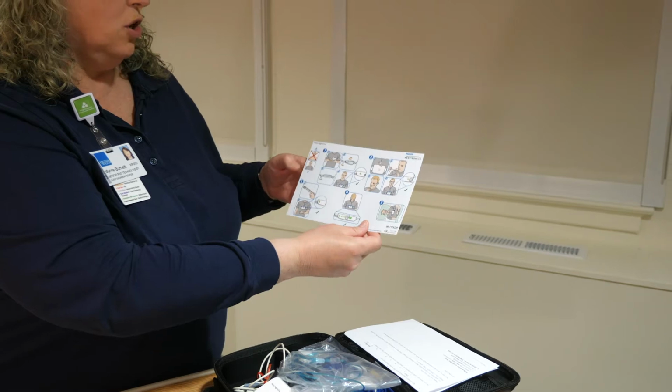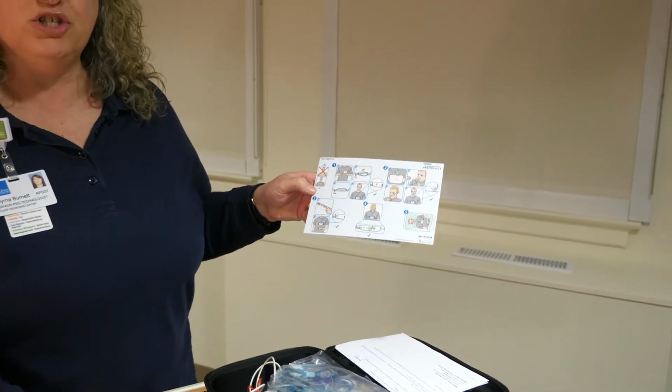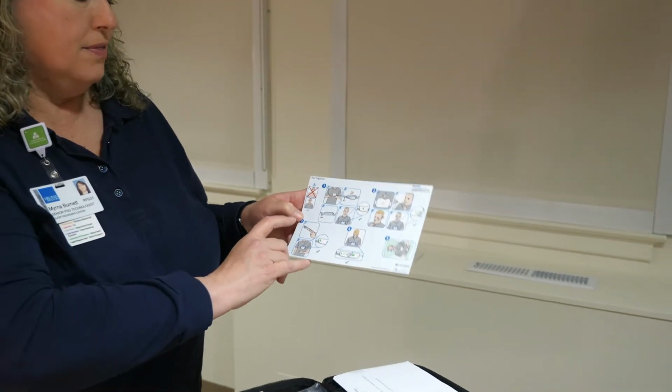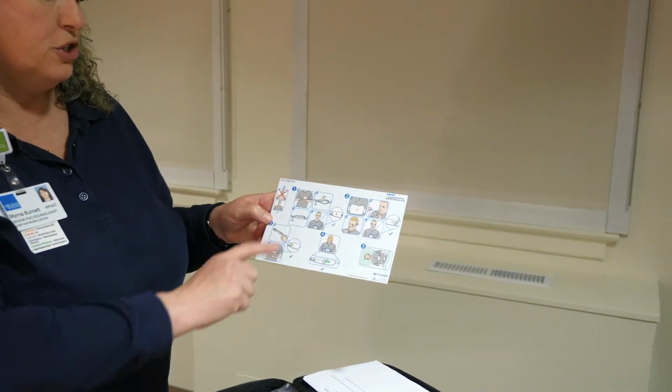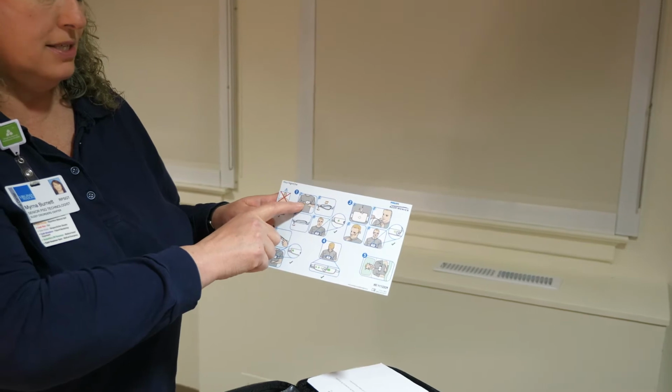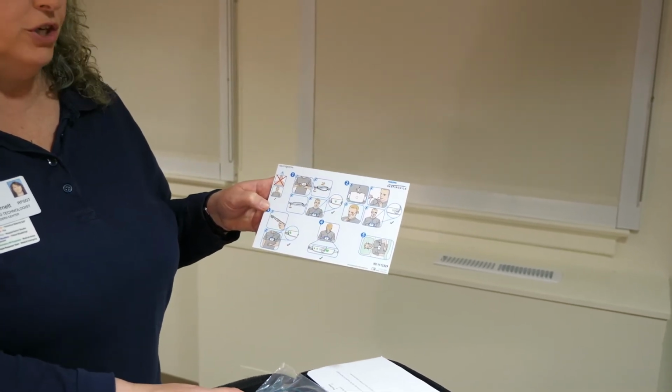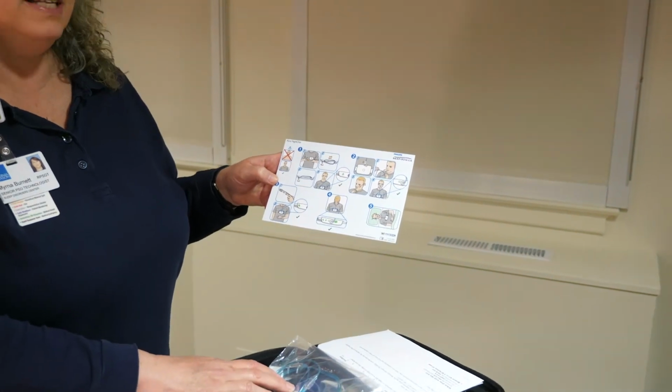tonight. One of the important things to know is that we want you to put this equipment on tonight over a t-shirt or pajamas. Okay? There are 3 sensors that you're going to put on. There's a respiratory effort belt that's going to go around your chest. There's a nasal cannula with 2 little prongs that's going to go in just the end of your nose, up around your ears, and then down under your chin.